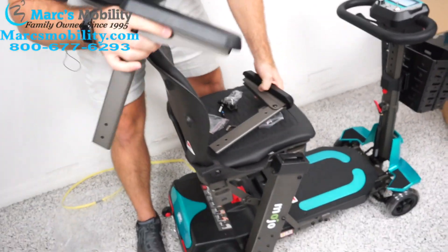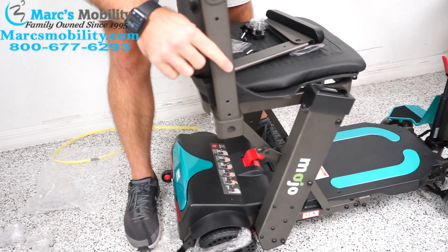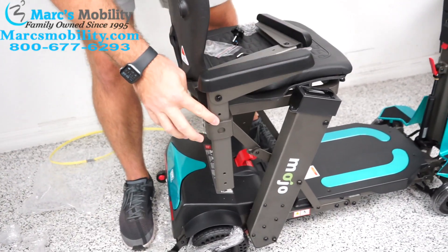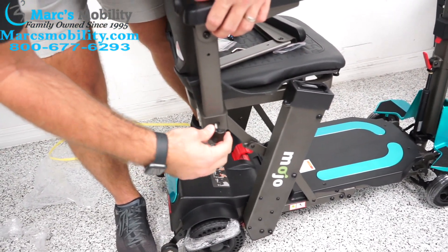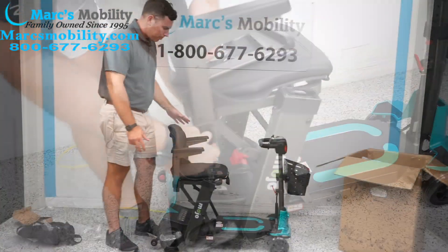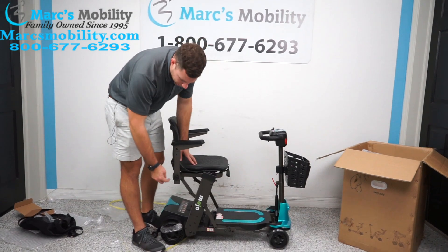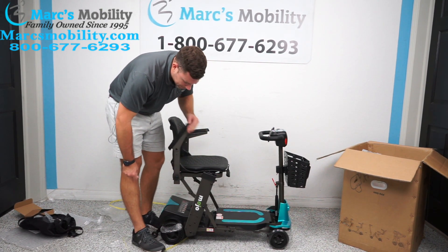On this side — easier to see on camera — you take the arm and drop it in. There are two hole placements depending on the height you want. Select the hole you're looking for, then screw this in. To recap: put your arms on and screw in the thumb screws. There are two different hole placements.